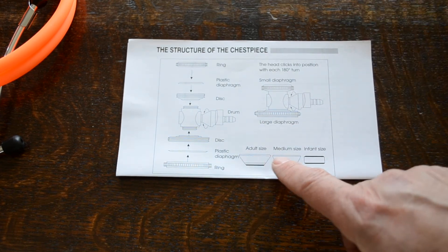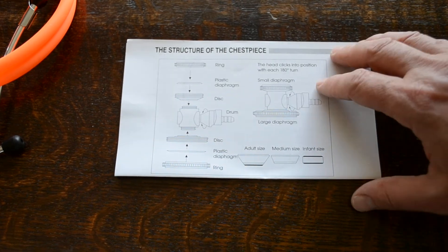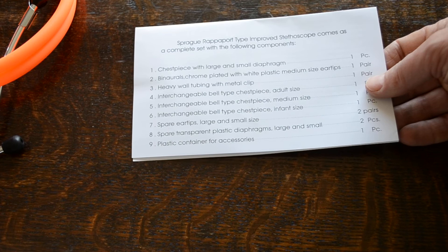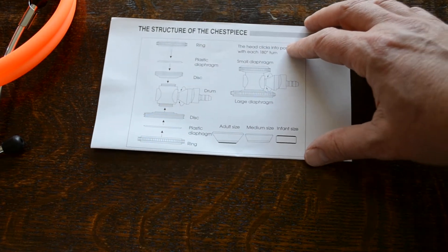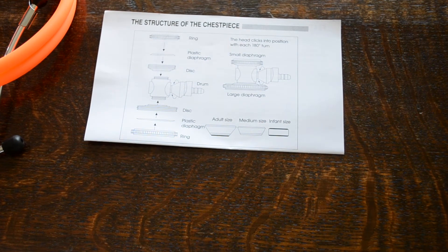As I say, we've got adult size, medium size or pediatric and infant size or neonate size options all included in that spares pack. And that just basically lists through the basic settings and shows you how to set those different settings up if you do choose to have a bell or a diaphragm option as opposed to two diaphragms.